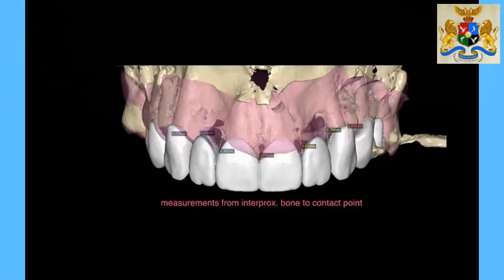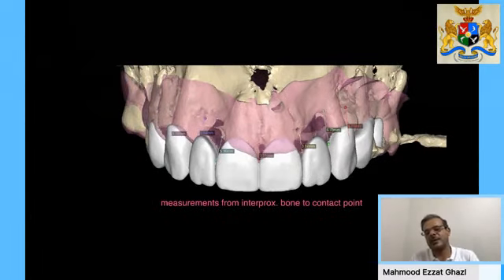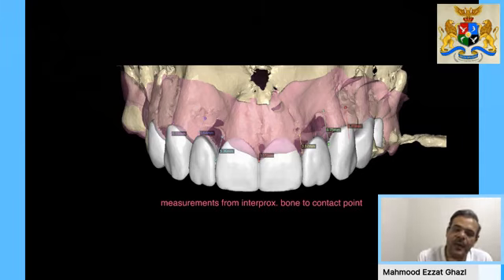Sorry about that. So going back to that, I can now see where my contact point is, where the CBCT is, and where the wax-up is. So I can visualize everything. So if I go back to the study that we were talking about, one of the best options would be implant to pontic relation or a tooth to tooth relation. So now I can relate where my implant can be placed, and if this relation is more favorable, will I be able to regenerate the deficiency in the papillas in this area or not?